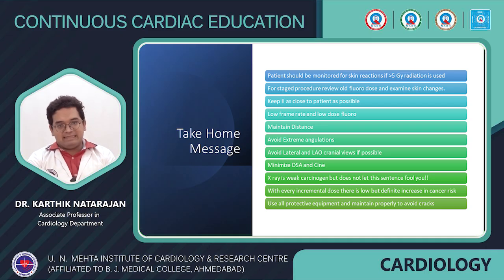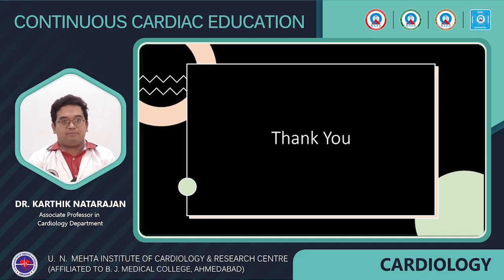Minimize DSA and cine. X-ray is a weak carcinogen, but do not let this sentence fool you. You have to be very careful. With every incremental dose, there is a low but definite increase in cancer risk, and use all protective equipment and maintain it properly to avoid cracks.